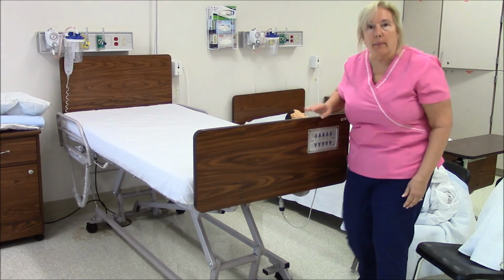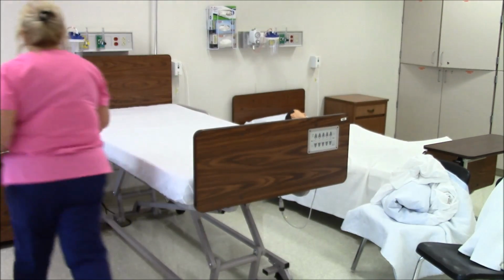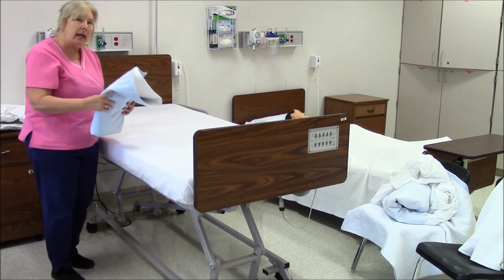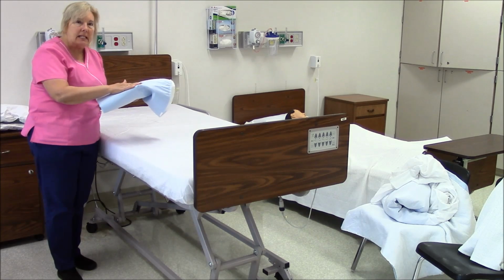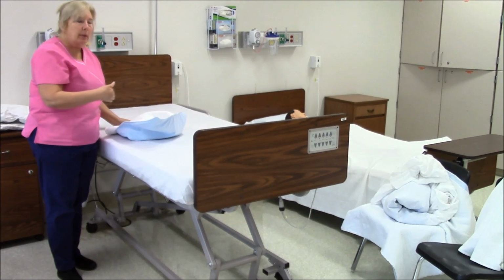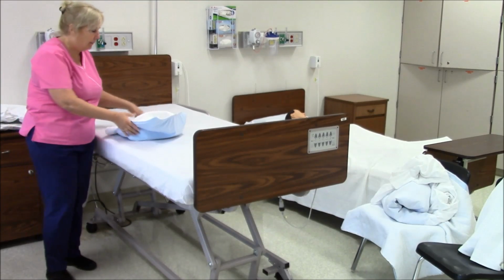The next step that I will do is to put the bed pad on. And again, my linen is in order, so my next article is the bed pad. There are actually two important steps with the bed pad: the plastic side needs to face down, and the other important part is to try to put the bed pad where the patient's pelvic area is.